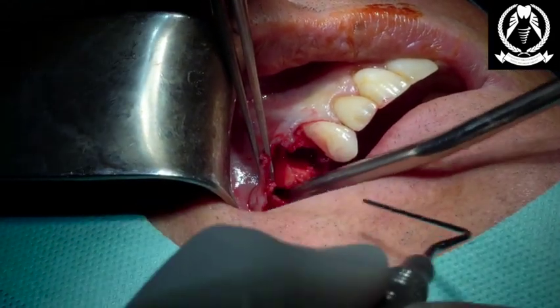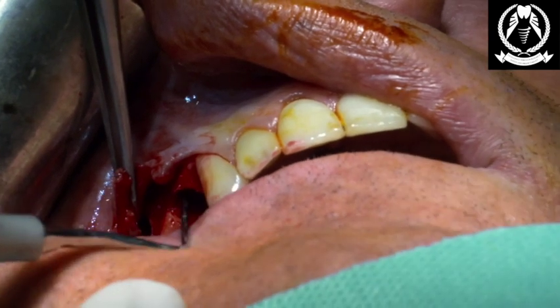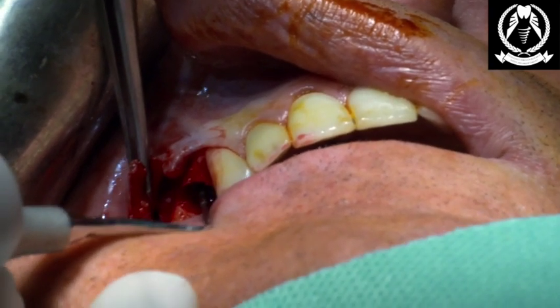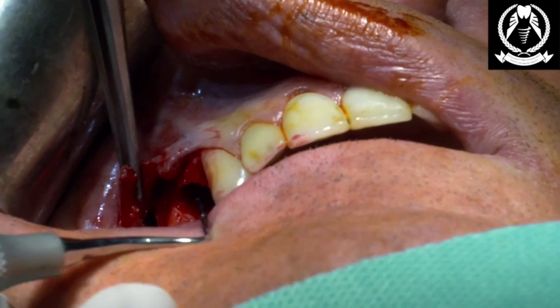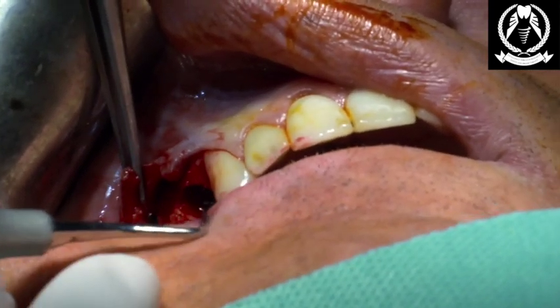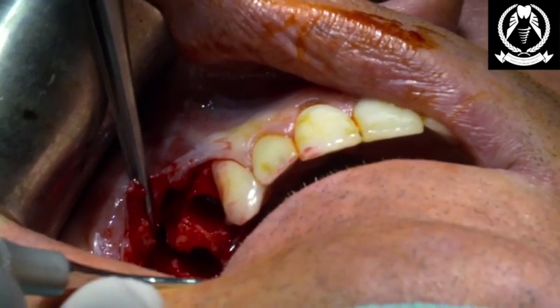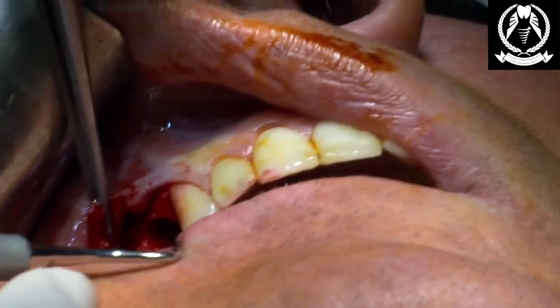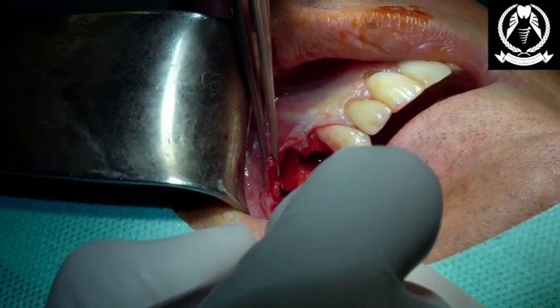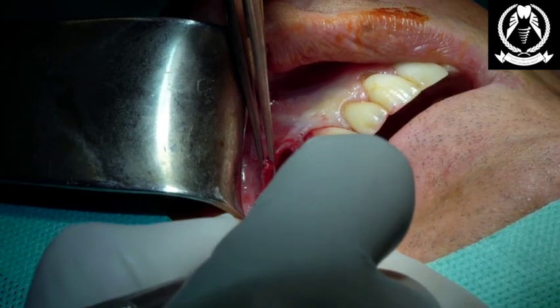Now, in the kit itself, I have a long, straight probe, which is blunt-ended. I like to feel the anatomy of the socket, feel where the base of the socket is, and decide on the positions of the implants. We know with the socket we have over 15 millimeters of bone, so we're placing a Megagen 15 millimeter by 3.5 into the socket there. We're doing an internal sinus lift, going about 10 millimeters there, 5 millimeters till we hit the cortical bone in that position.